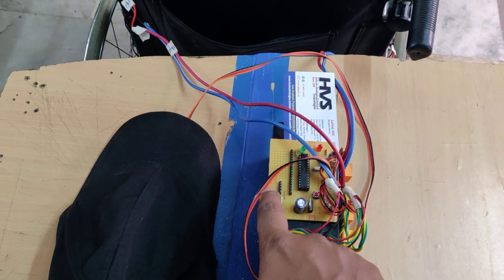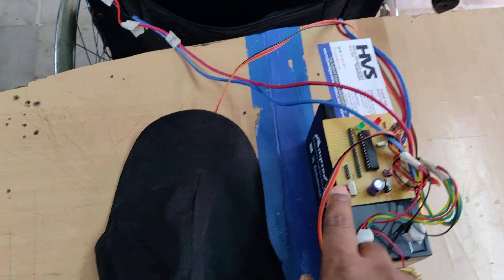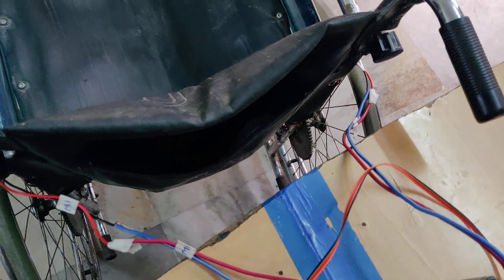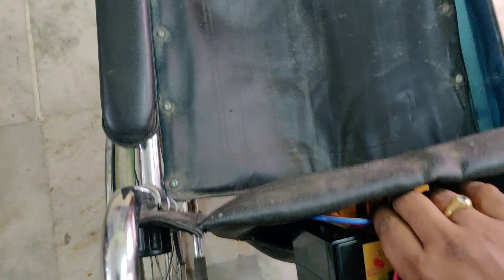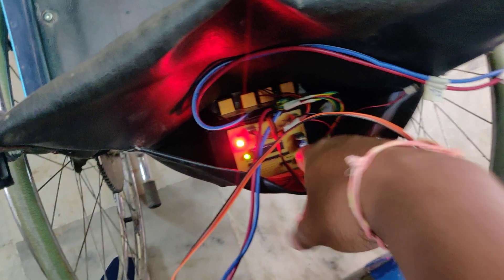This is the main on/off switch. We place the sensor on the head and set it. Then we switch it on.